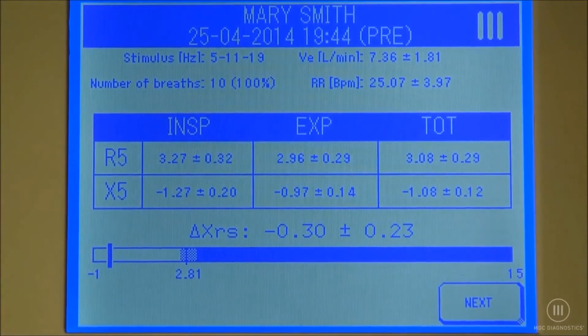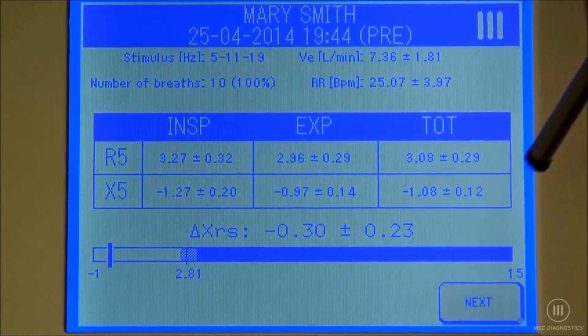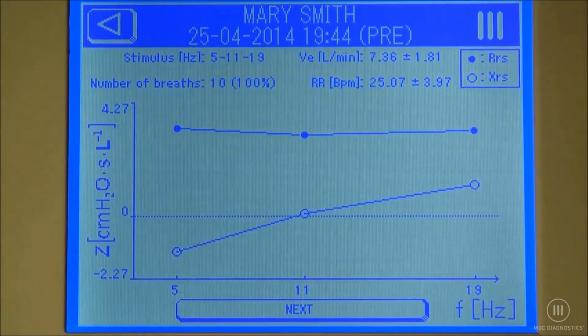The numerical data will be displayed. After selecting next, the graphical data will be displayed. Press next after reviewing the graphical data.